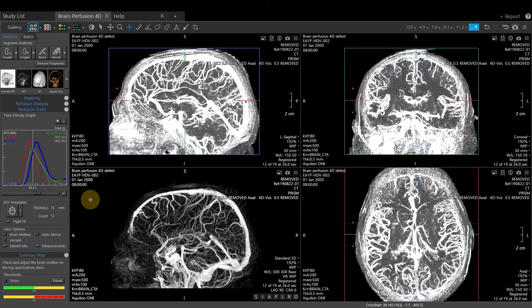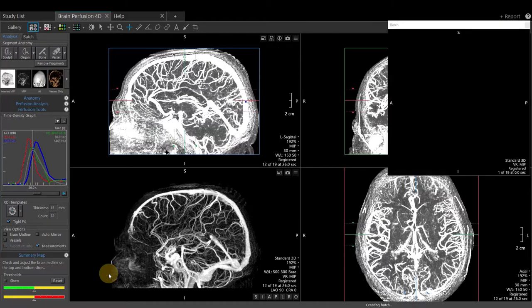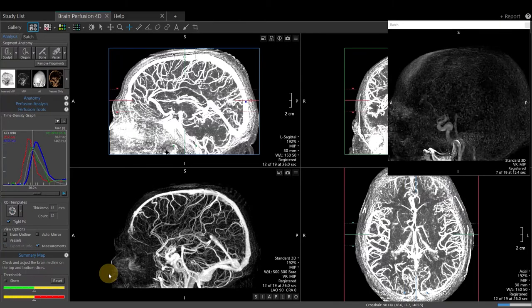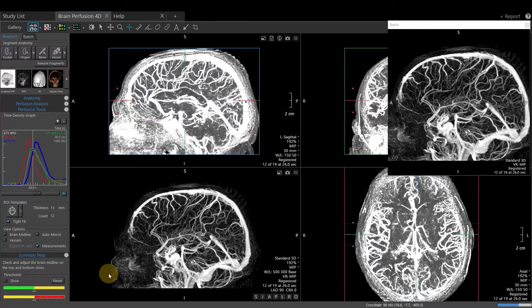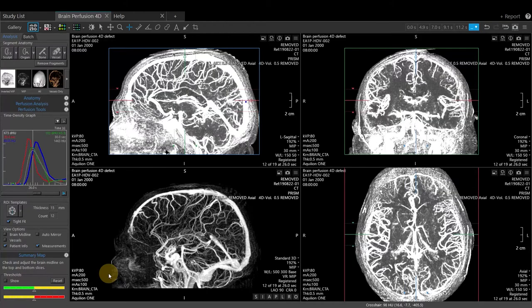To save this as a 3D DSA, right-click in the 3D viewport. Select Batch 4D Cine. A pop-up box will appear at the upper right, displaying our Cine data.